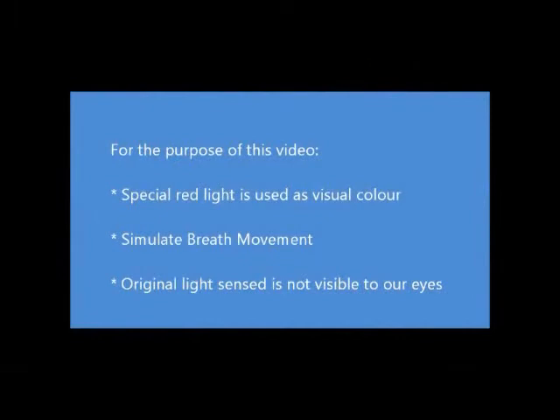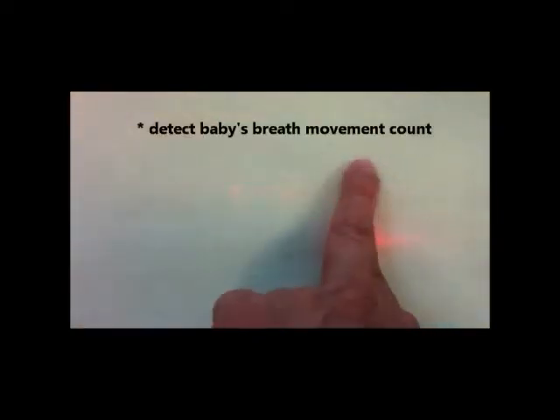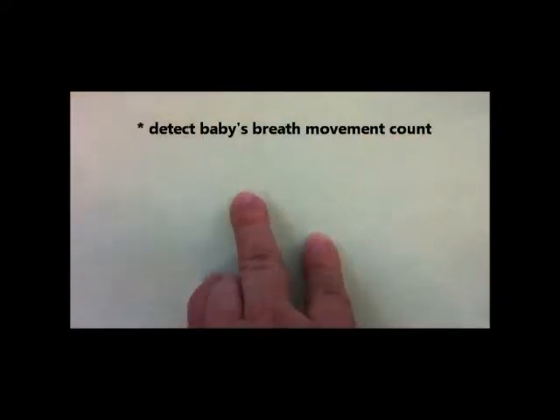For the purpose of this video, to help us see the simulation of the breath movement, a special red LED light is used as a visual color. The original light sense is not visible to our eyes. iBabyGuard Fiber Optics at Work — this is to illustrate the working principle of iBabyGuard Sleep Monitor that detects a sleeping baby's breath movement count.